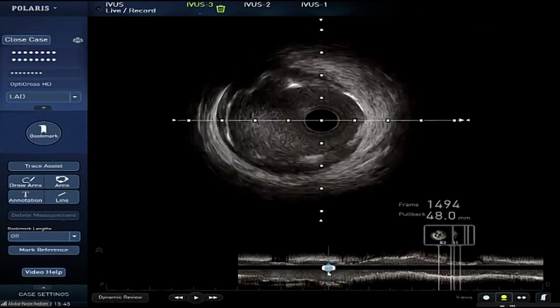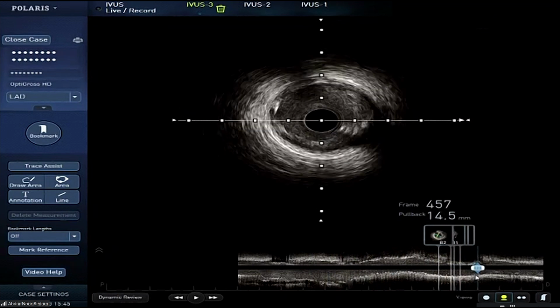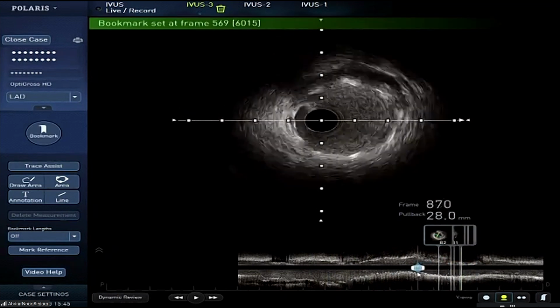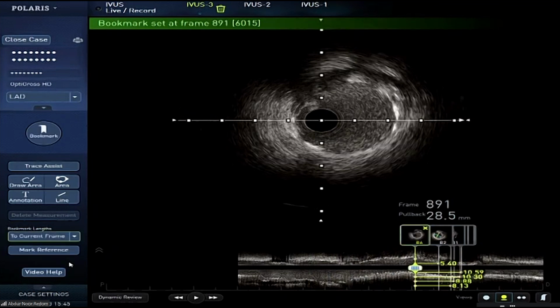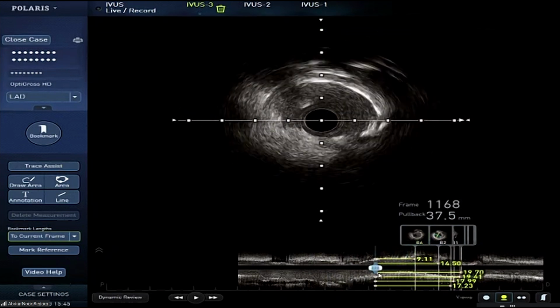Some people have said that 900 micron of stent under expansion, malapposition is important, and that we should do something about it. And if it is more than 180 degrees of stent malapposition, that also we should expand more. But that's all some research data that came from Patrick Serruys' group.